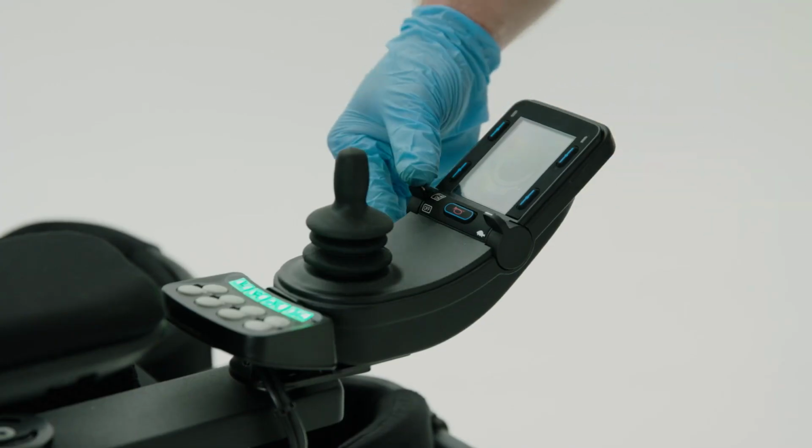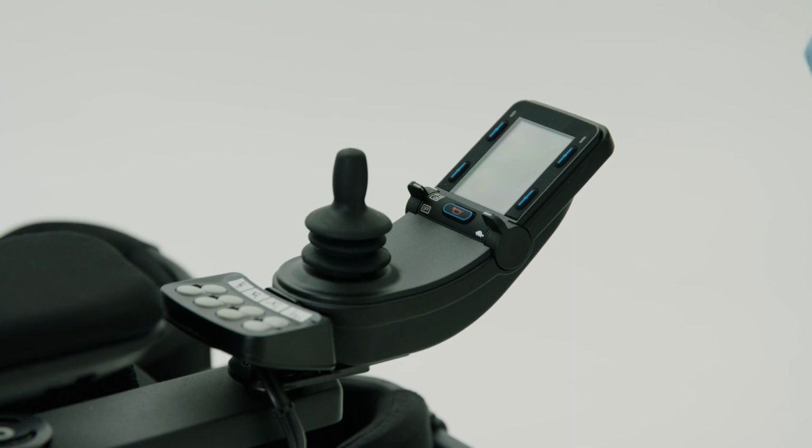And now, let's review what you can do to clean your Permobil power wheelchairs. Before we begin, remember to keep your wheelchair powered off during this cleaning process. Generally, you should not use solvents or abrasive cleaners when cleaning your Permobil power wheelchairs. Let's start with some of the most touched surfaces that will need cleaning.